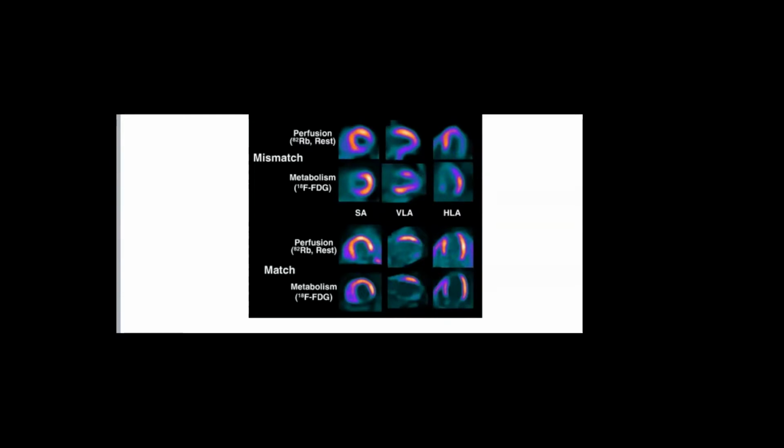And we demonstrated why it's hibernating: because there is no perfusion, but there is metabolism. But we are talking about the area that had perfusion but appeared as if it has no metabolism. Is this normal or abnormal? Normal. Why is it normal?